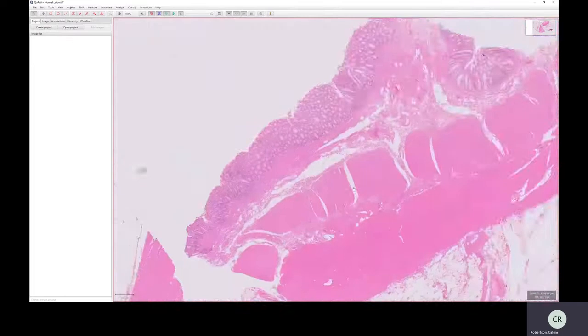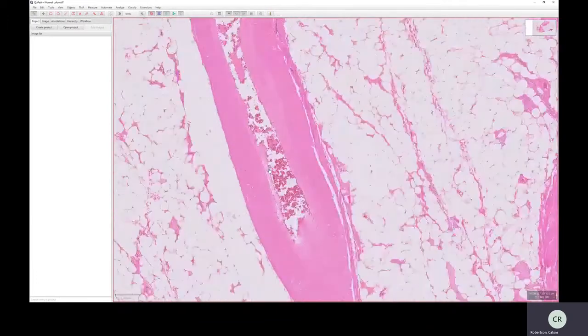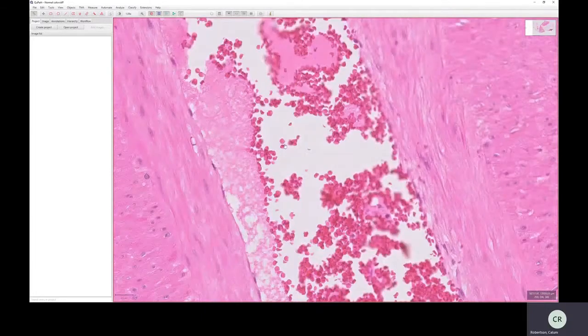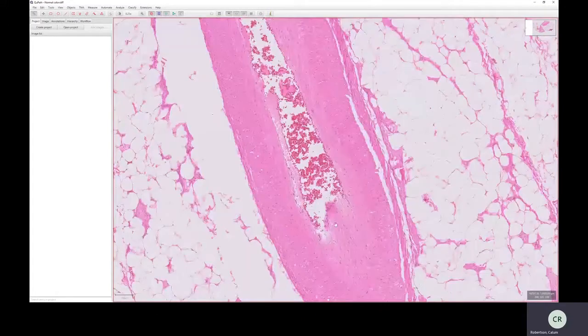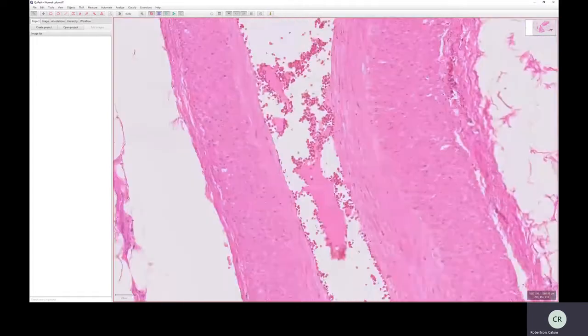And the one last thing, we didn't have really good examples of blood vessels in the skin, but here we've got a really good example of an artery, where we can see erythrocytes in the center, which I can identify easily by their concave shape and absence of a nucleus. This is the lumen of the blood vessel. Lining the lumen are elongated, single cell layer endothelial cells. That's the nucleus, this is the cytoplasm. Here's another nucleus, and they're forming tight junctions, sealing off the lumen.